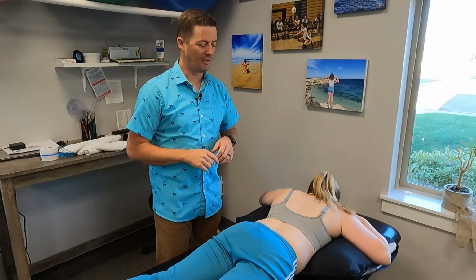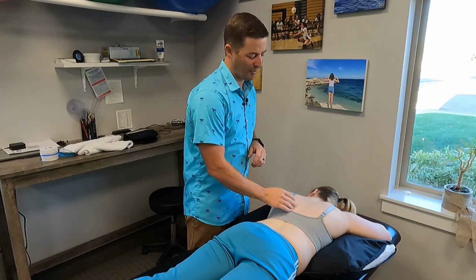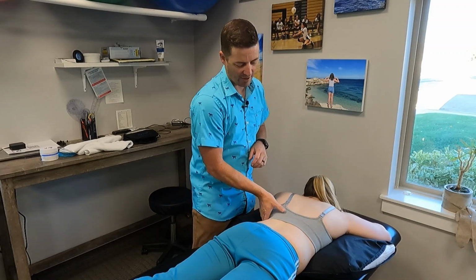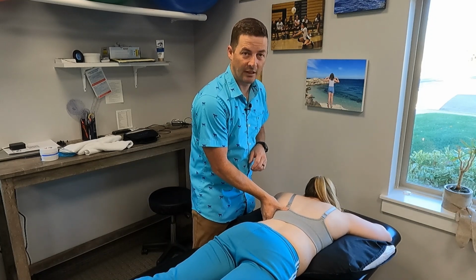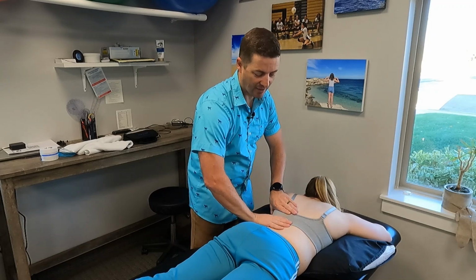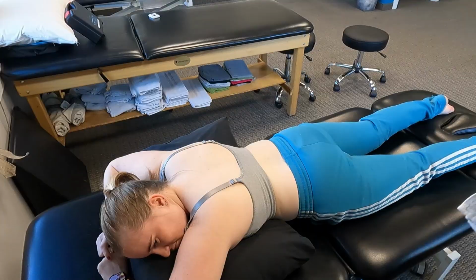So Amber, go ahead and lay on your stomach. Usually I'll have the person lay on their stomach with a pillow under their chest or under their stomach, just to bring their back up a little bit. And just to orient ourselves to Amber's back, we have a prominence through here, but her main concavity is right here, right below the left shoulder blade. And right here is where we're going to focus. We're going to try and loosen this up and then manually open this left side.